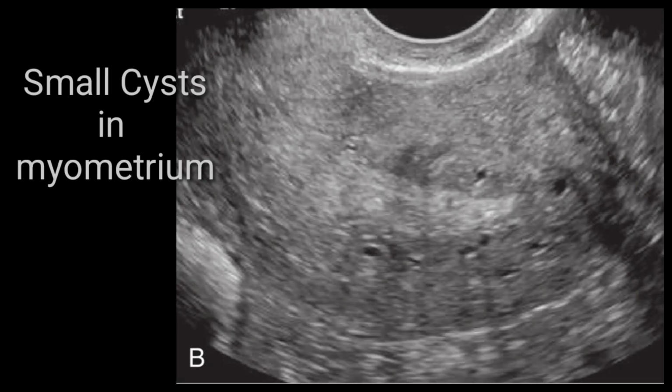On this transvaginal scan, this is another example of adenomyosis, but the pattern is different. Here you can see tiny cystic lesions, or tiny small cysts, within the parenchyma of the myometrium. So multiple cysts can be seen. This is another example of adenomyosis. So adenomyosis may appear in this form.